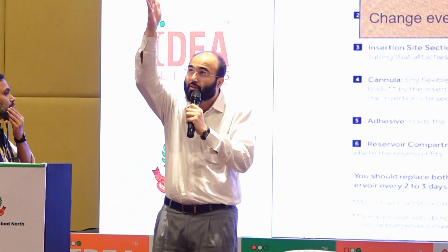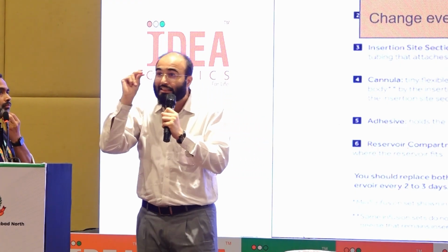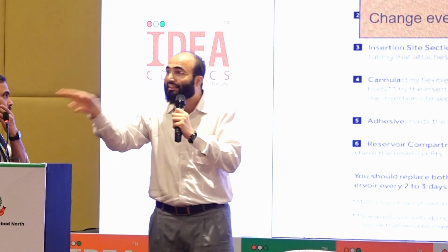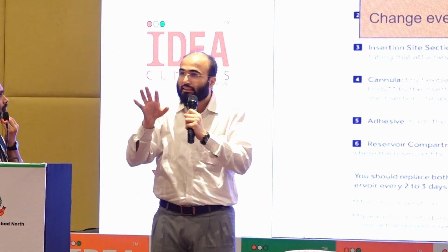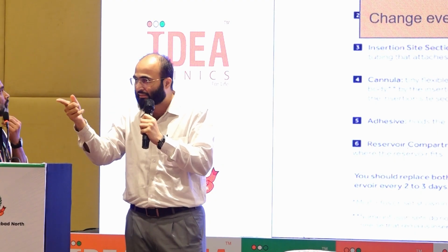If it is perpendicularly up, straight up, then it is increasing more than 2 milligram per minute. Right? So in the next 10 minutes, it's going to increase by 20 milligram. If it is slant, northeast, then it is 1 milligram per minute rise.